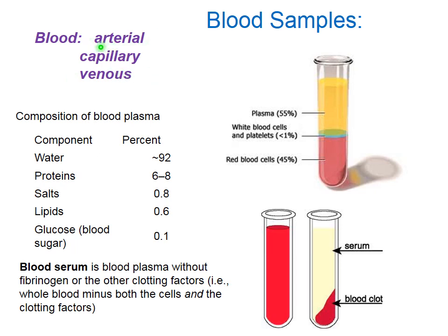Now, just a reminder, blood can be arterial, very difficult and dangerous to collect. You can kill the person. A very close mimic of arterial is capillary blood, just pricking a finger, collecting several drops. If you need large volumes, venous blood is very common. Well, collecting blood from dead people, it's a separate story. You can look in your textbook about that.